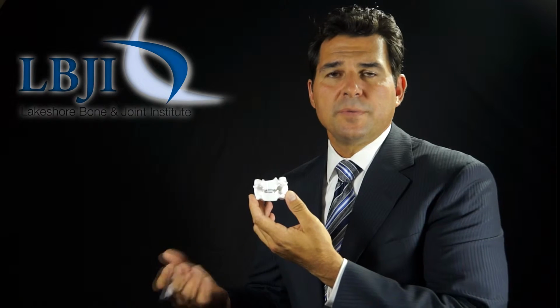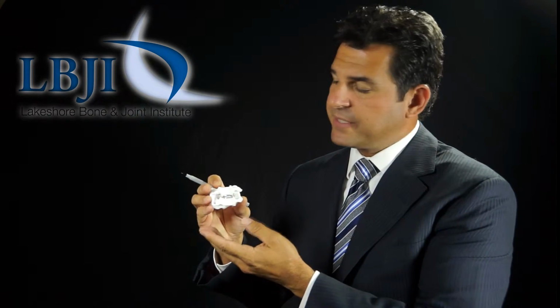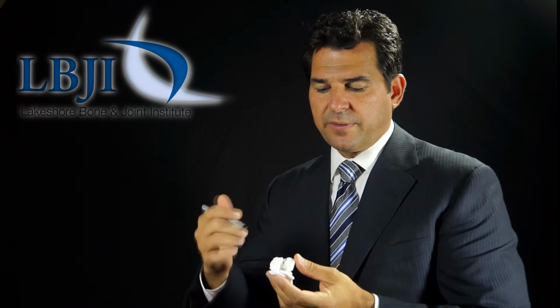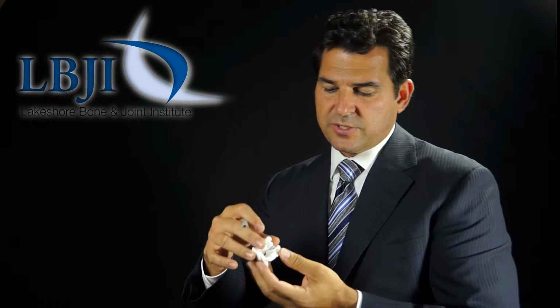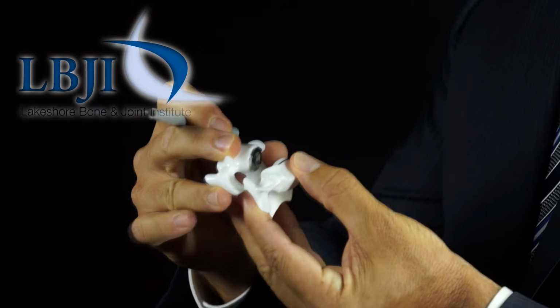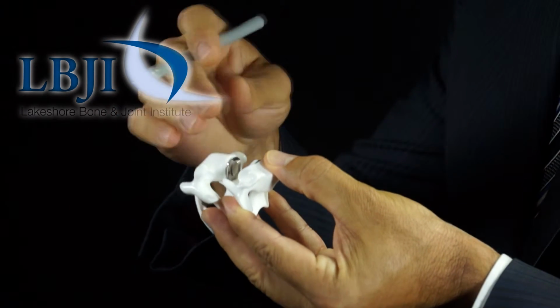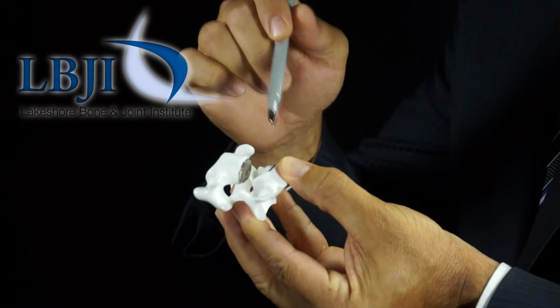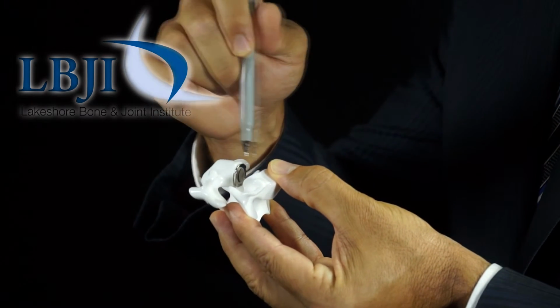As far as how the surgery is done, this is the cervical spine in an upright orientation. Patients are laying on a table in surgery, and typically what's involved is cleaning out the native disc that's causing the problem and cleaning out the disc herniation. I'll take this apart to give you an idea what that looks like. We don't take the spine apart like this in surgery, but it gives you an idea of cleaning out in between the bones where the disc herniation is, to clean out where the nerves come out the side of the spine.